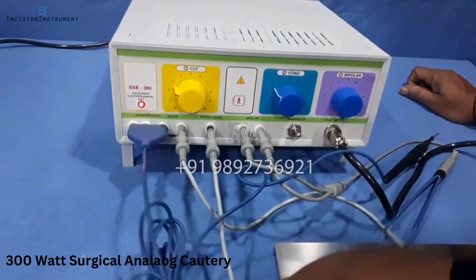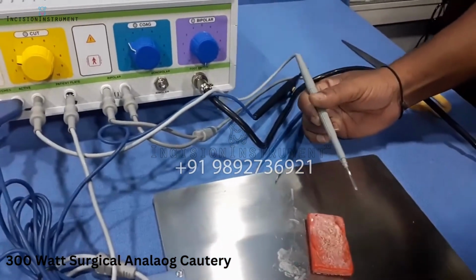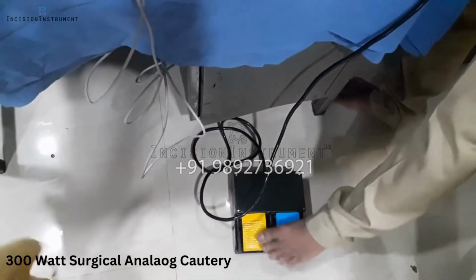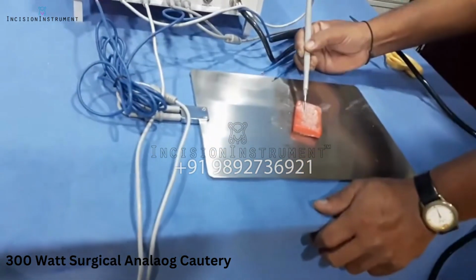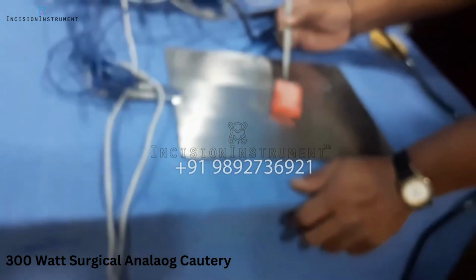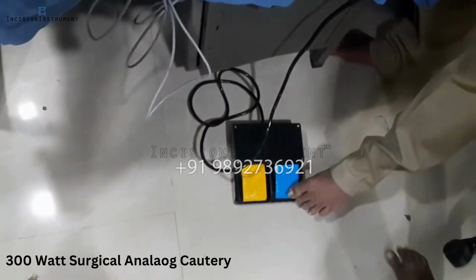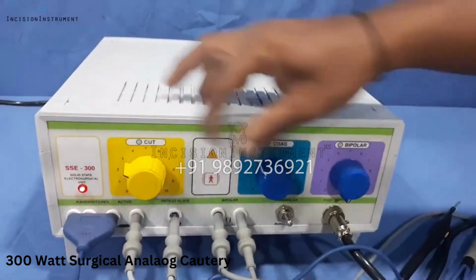The second port is for the foot control. When you are using a foot control, you have to control the machine with the foot. Blue is for coagulation, yellow is for the cutting. When you are doing cutting, you have to press the yellow button for the cutting mode. Blue is for the coagulation mode. Intensity will depend on you, how much intensity you want.